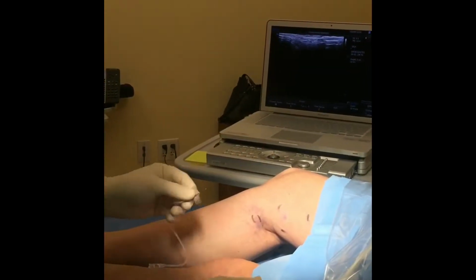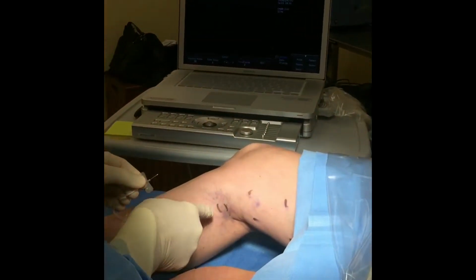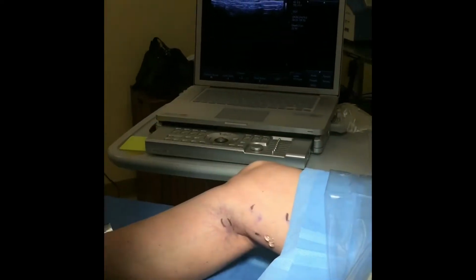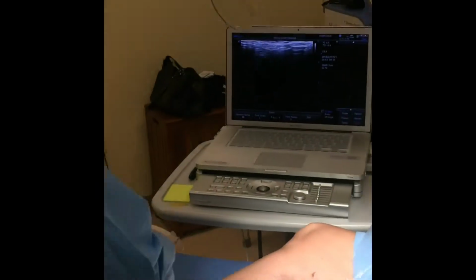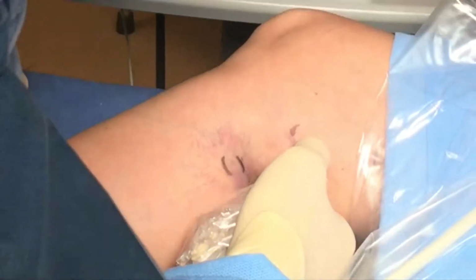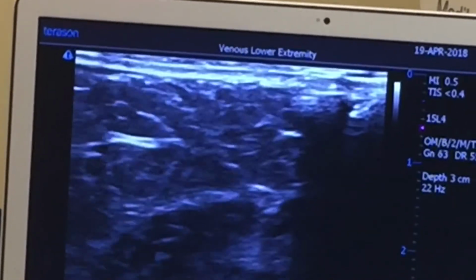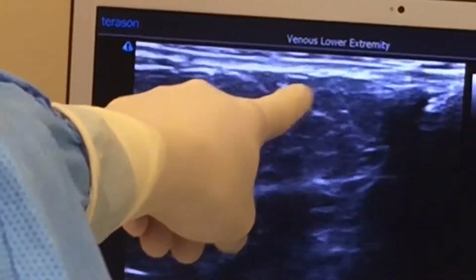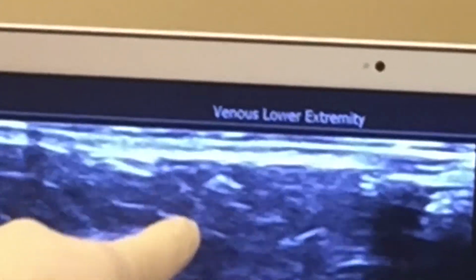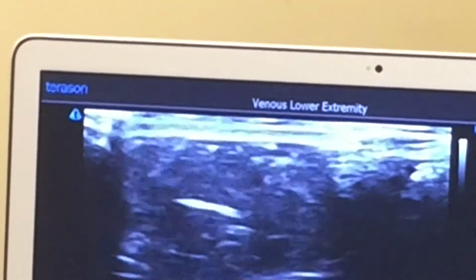So what we're going to do is advance this little butterfly needle into the feeding vein that is feeding these veins down here. If we look on the screen, at the very top of the screen, it can be hard to see, but there's a little circle right there. And that's a vein. You can see it open and close when I push on it with my transducer. That's our target. It's not very big. It's a little less than 2 millimeters in diameter.